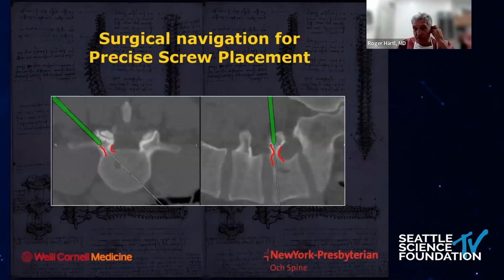And I use it with 3D navigation. If you have an anatomy like this, for example, I think with a robot I'd be very, very worried, because in my opinion, I don't use it, but my concern would be that you don't really get any tactile feedback. With freehand 3D navigation, you dissect down with your finger, you can feel the anatomy, and you can get really nice tactile feedback, even when you put in your pedicle screw.